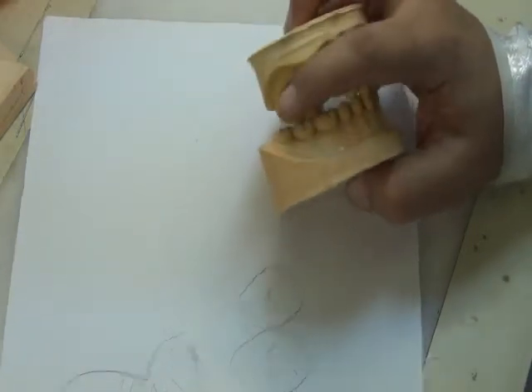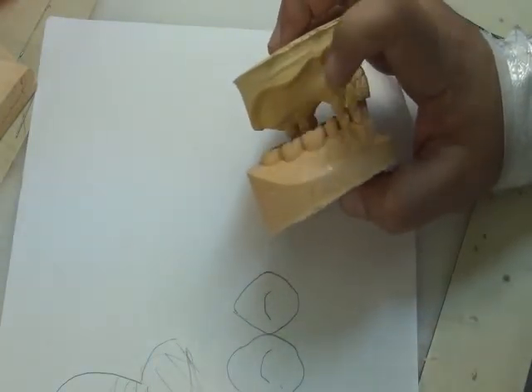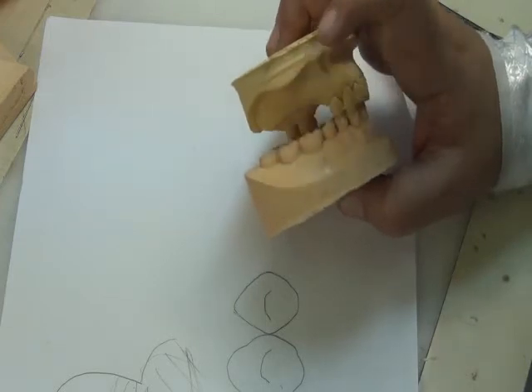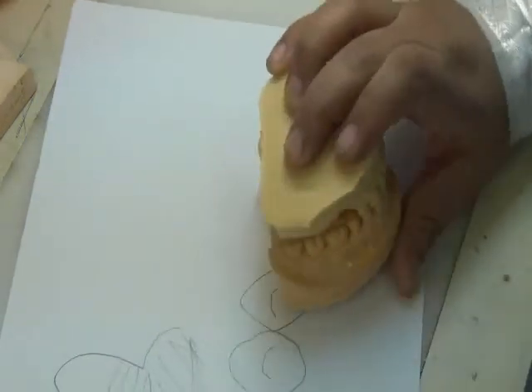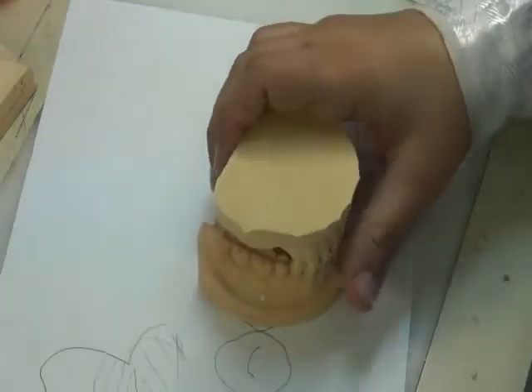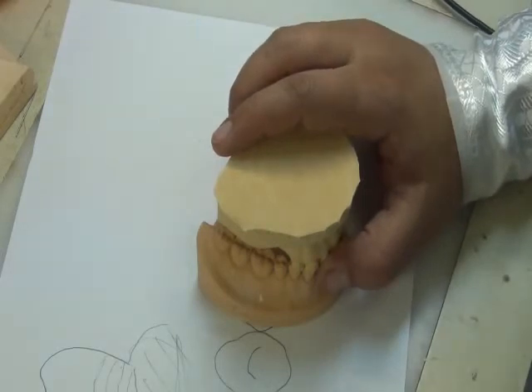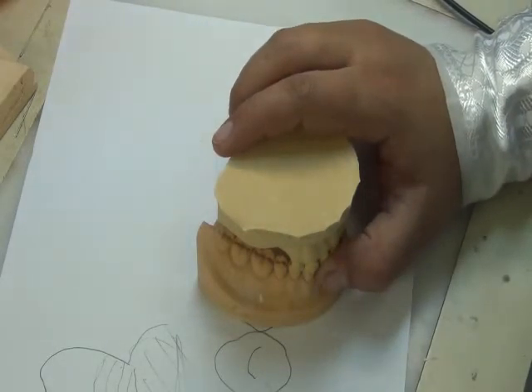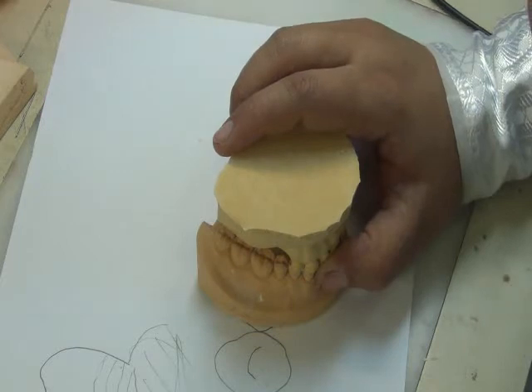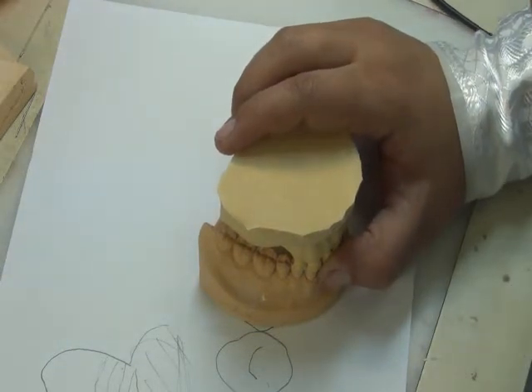And we have made him a base plate with a wax rim, a partial base plate with wax rims there. And we let the patient bite on the wax, and then the wax comes, we put it on the cast, and we mount this according to the wax registration. We will see it in further detail when we go to the lecture. You will see it with images, okay? So when we have free-end saddles, we have to do the jaw registration.